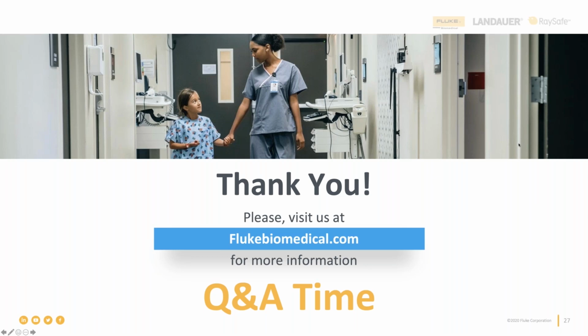All right, next one is: is SpO2 pinpoint accuracy important? What if readings are 1 or 2% off? Yeah, so this is really up to the manufacturer, right, in terms of service. So they're going to say, hey, test this pulse oximeter and make sure that when you put in this reading, it's accurate within plus or minus X percent. So that's ultimately what biomeds should be following for service.